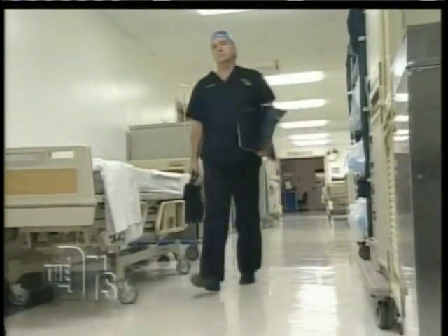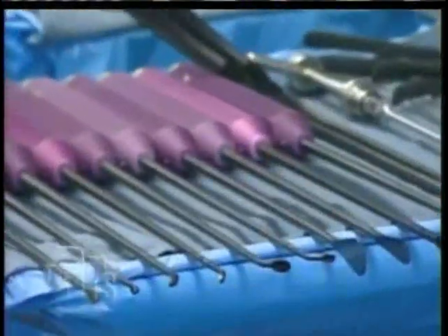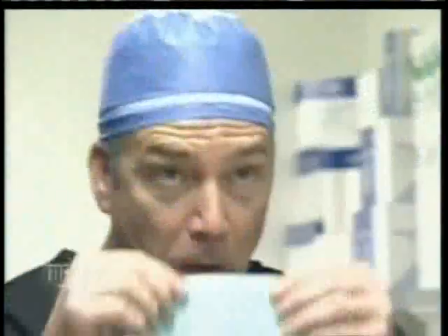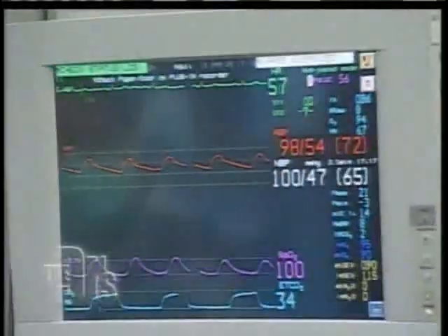Mark had had back problems for a number of years and has been incapacitated by these back problems. I'll be okay. So our surgery today is called the extreme lateral approach to the spine, or XLIF. This technique is revolutionary for a number of reasons. One, it's minimally invasive. Importantly, we leave those strong lumbar muscles intact.